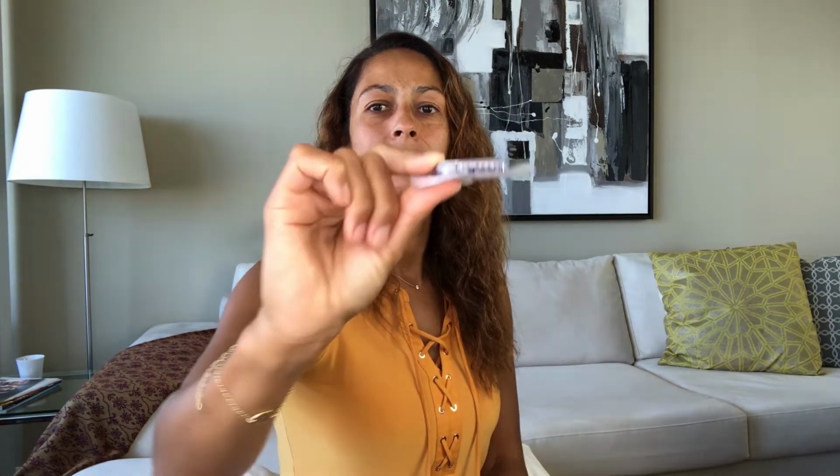So now the sensor is off, and as a little bonus, I want to show you how to get your sensor and your transmitter separated. Because don't throw this out. Remember, a transmitter, which is a great part of this device, is what lasts you 3 months. Okay, so let me show you.